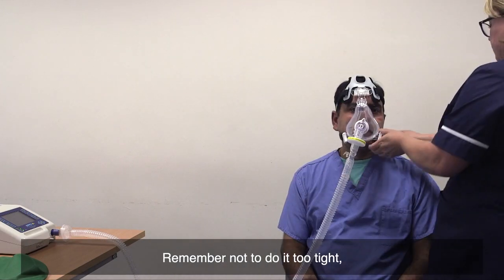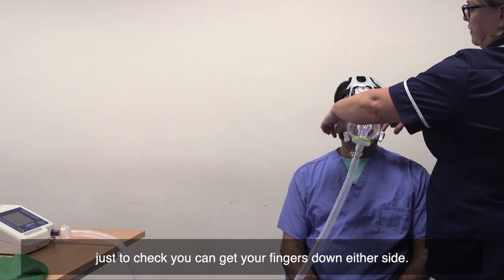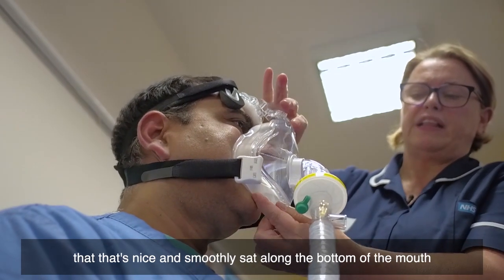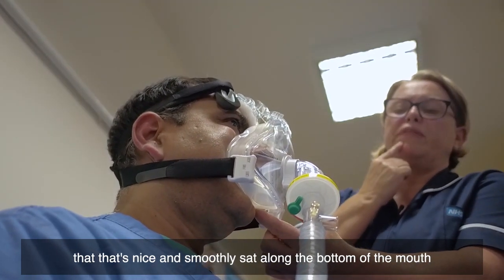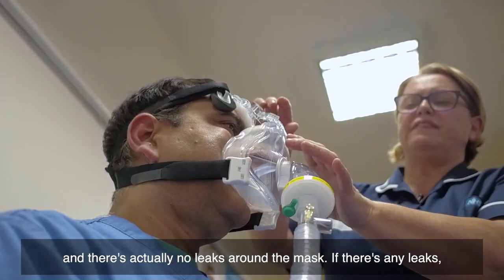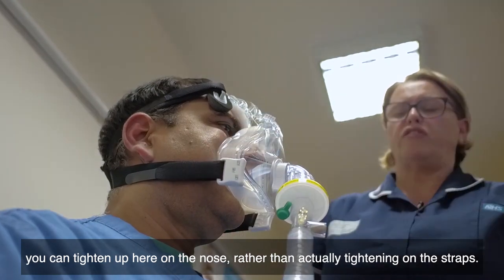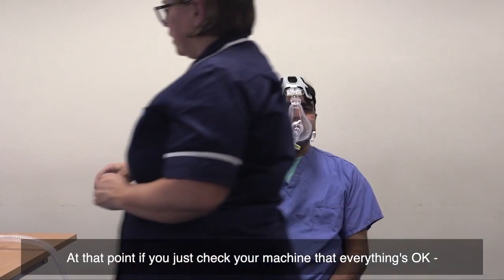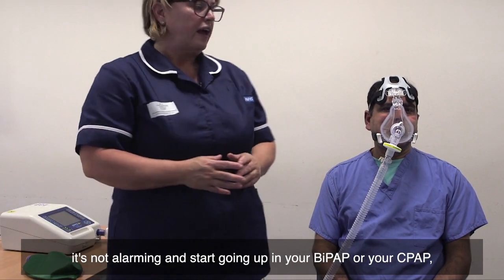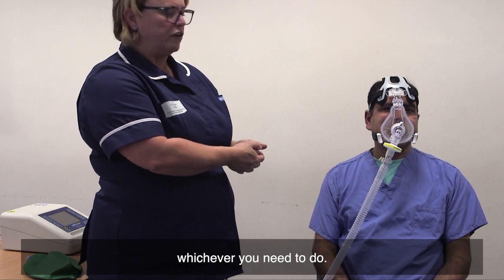Remember not to do it too tight — just check you can get your fingers down either side. Once you've got the mask in situ, make sure it's smoothly sat along the bottom of the mouth and there are no leaks around the mask. If there are any leaks, you can tighten up here on the nose rather than tightening the straps. At that point, check your machine that everything's okay, it's not alarming, and start going up in your BiPAP or CPAP, whichever you need to do.